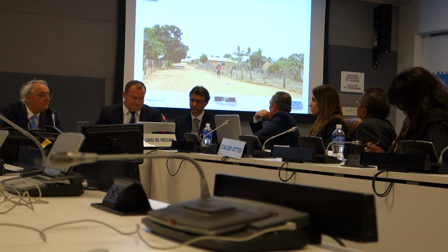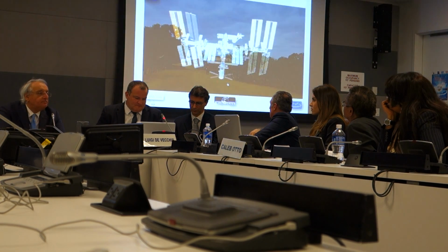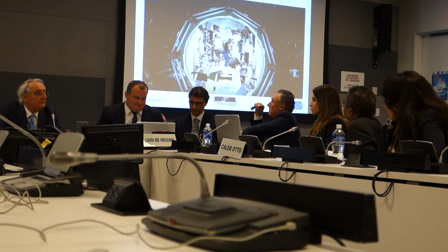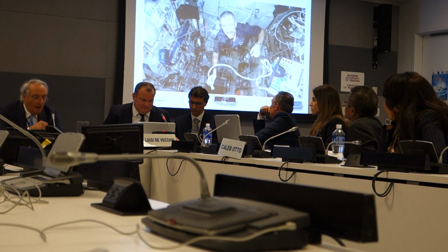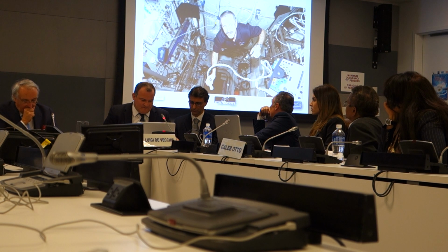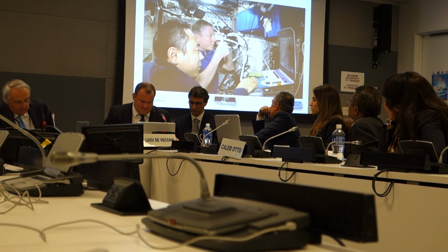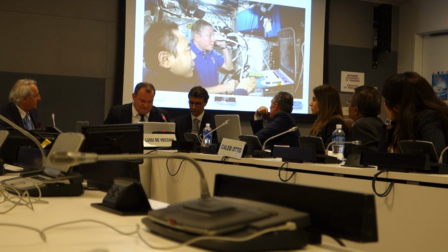Providing medical care for people in remote locations, like distant rural communities or the International Space Station, can be difficult, because trained medical personnel are not always available. NASA research teams develop techniques that enable astronauts aboard the space station with minimal training to operate an ultrasound device using simple printed cues.